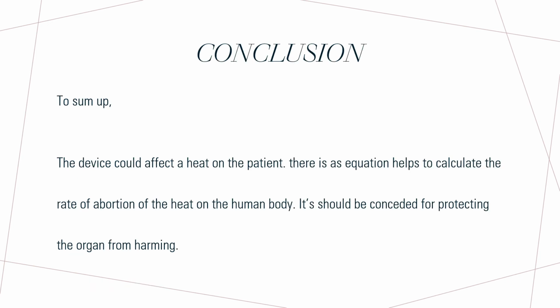So in the conclusion, MRI is one of the most important devices, and uses an electromagnetic field to image human body organs. One of the considerations that should be taken is the SAR, for avoiding increasing patient body temperature. There is a calculation explained that helps show how to calculate the SAR.